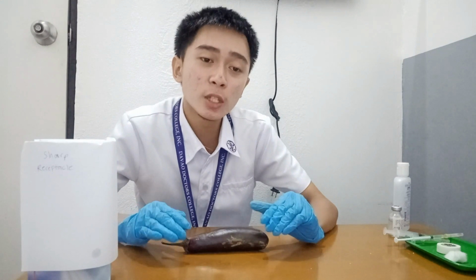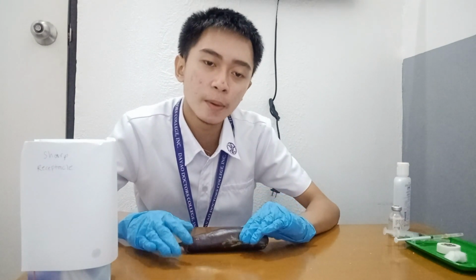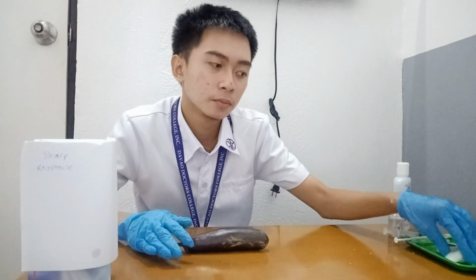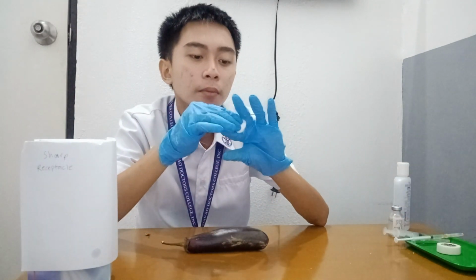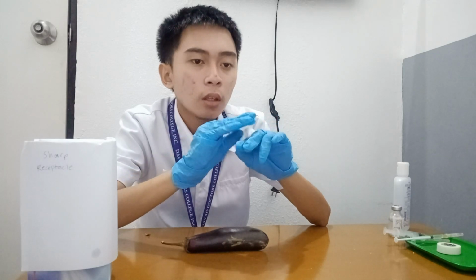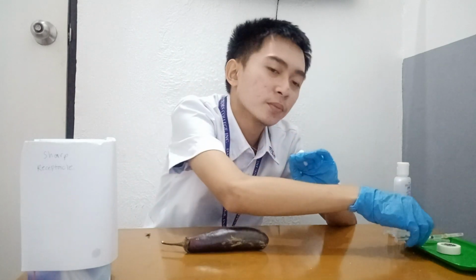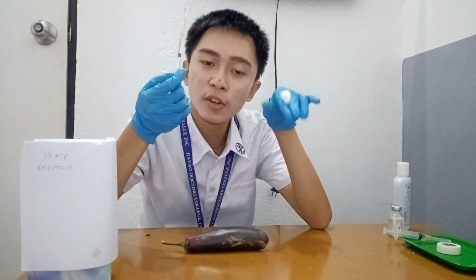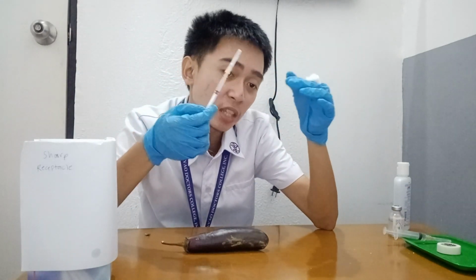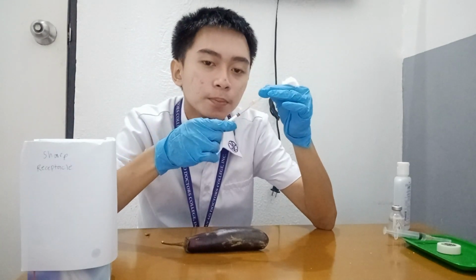Place and hold the swab between the third and fourth fingers of the non-dominant hand, or position the swab on the client's skin above the intended site. Then prepare the syringe for injection. Remove the needle cap while waiting for the antiseptic to dry, and pull the cap straight off to avoid contaminating the needle with the outside edge of the cap.